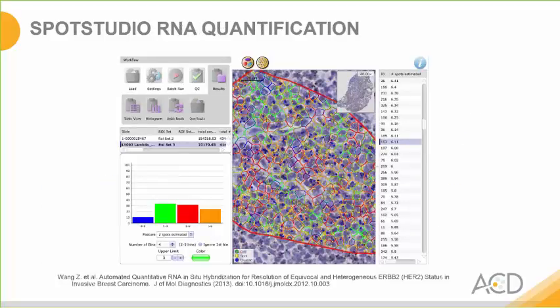An example of SPOTSTUDIO image analysis, in this case for the biomarker HER2, breast carcinoma, is demonstrated in this slide. The software identifies cell boundaries, shown with this sort of chicken wire lattice work, through the approximation of average distances between the cell nuclei. The algorithm then counts dots within each cell as defined by these cell boundaries and bins the cells by color according to the number of dots per cell.